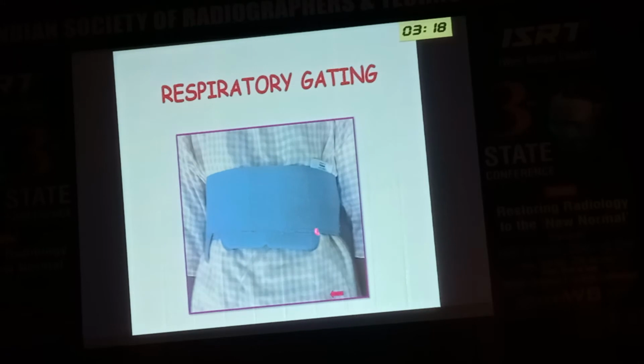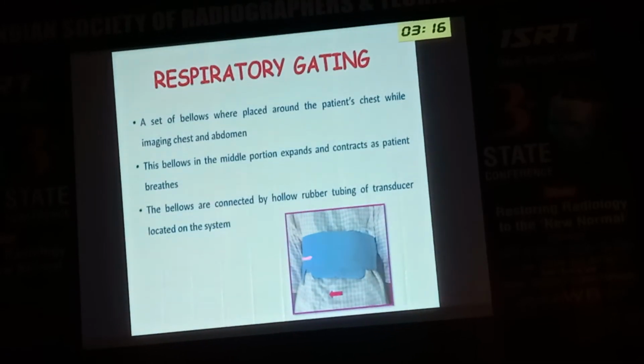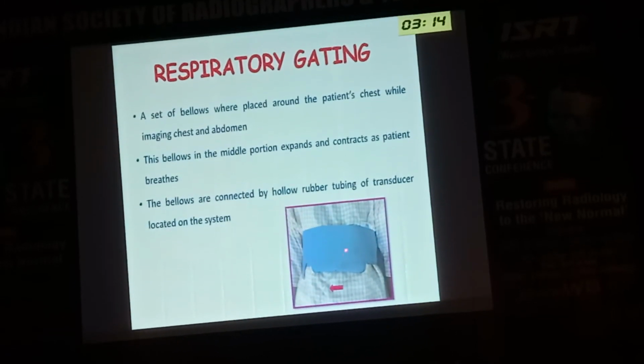Inspiration, expiration, isn't it? Movement is there. I want to do a chest imaging, I want to do an abdomen imaging, particularly chest imaging. I have a respiratory gating. I have a bellow which produces this. So can you see it? This bellows in the middle portion.